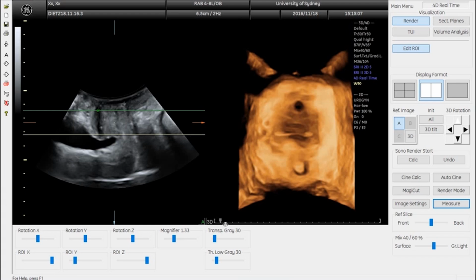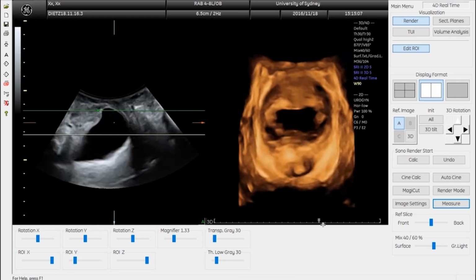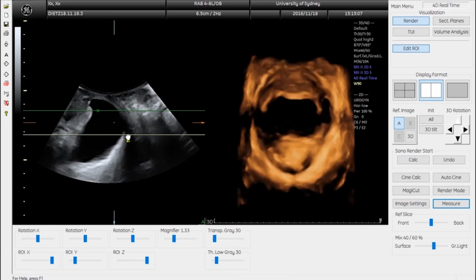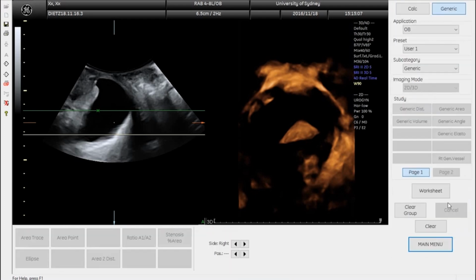box extends laterally. So we're going to get her to do a Valsalva here by letting the timeline run to the right. This looks like it is maximum Valsalva. We shift the box so that our line of reference here goes through the inferior margin of the symphysis pubis.